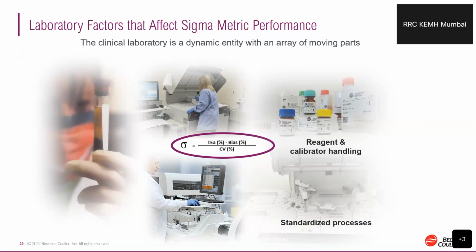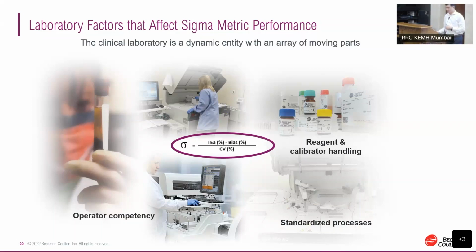Over a period of time, your analyzer components may be getting deteriorated. Maybe the optics is not performing well. So we adjust those differences to get the desired value. So calibration is important, and calibrator material is important. With calibrator material, we are looking at whether those values have traceability to certain authorized bodies.